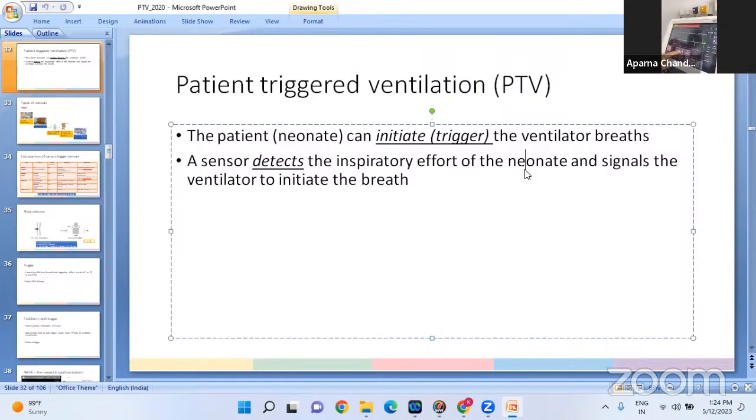If you want to add pressure support to SIMV, then over and above whatever set breaths that you have set, the additional breaths of the baby will be supported by pressure support. So that is an optional thing. You can long press in order to choose it. So if the patient breathes at anything more than 30 breaths per minute, the additional breaths will be supported with a pressure support of 8 centimeters, whereas routine breaths will be supported with PIP of 17. So this you can again increase or decrease based on the requirement.